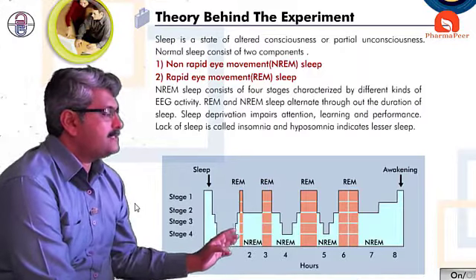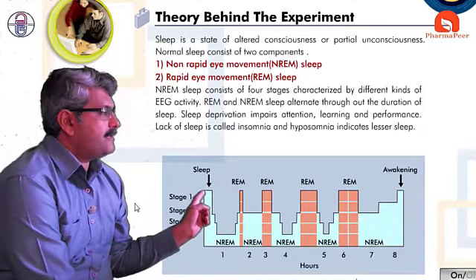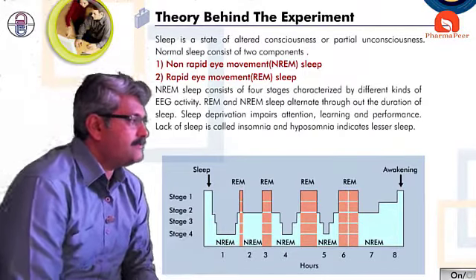So with the help of these stages, we are going ahead. This is when we start to sleep, and the last one is when we awake. So this is a graph that gives this information.